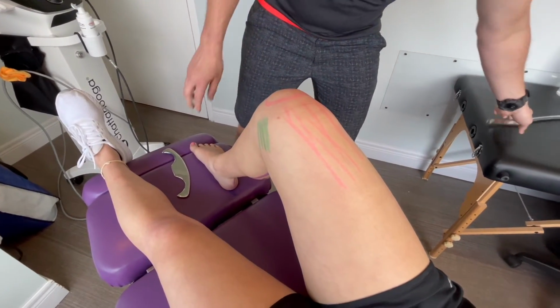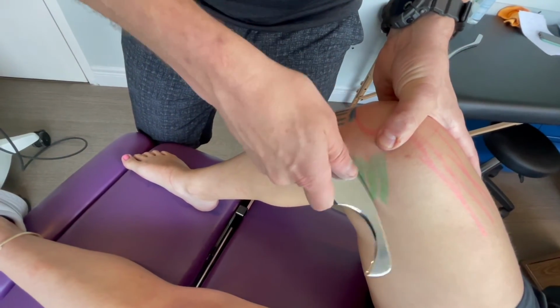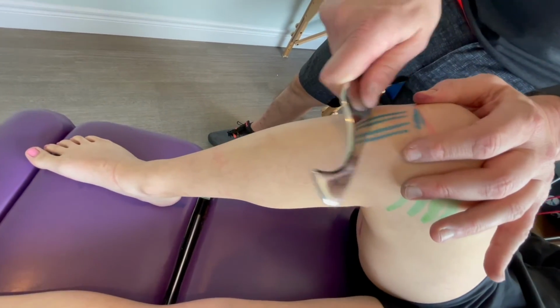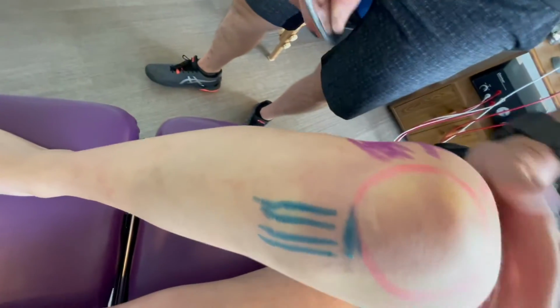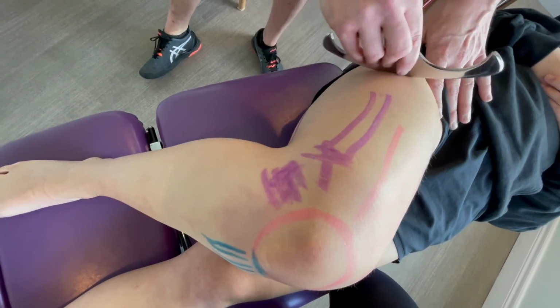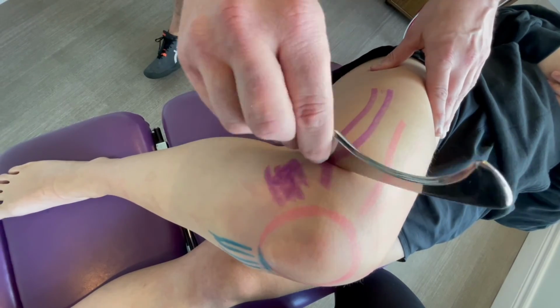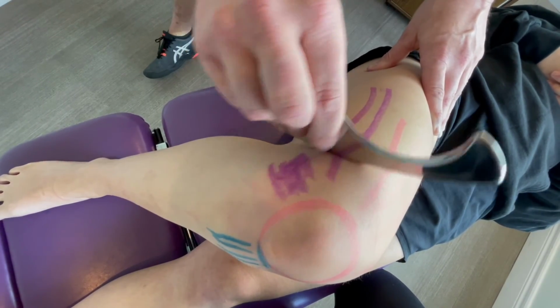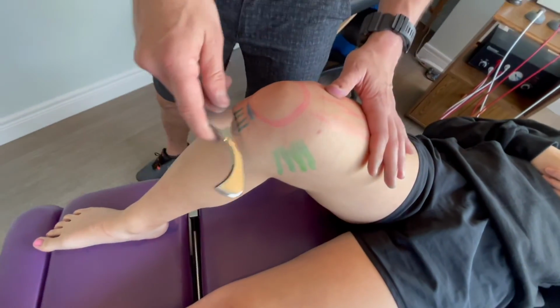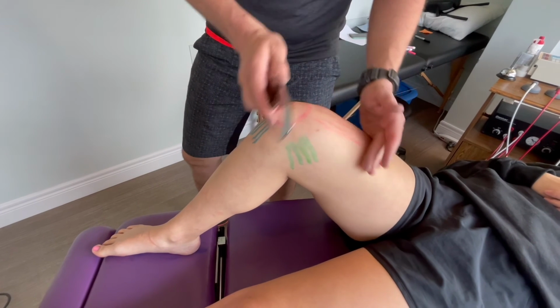If it was a meniscus injury, I'd come in with a different unit and scrape in through the side here. Patellar ligament, I'd come in right like this, and then lateral in there. When it is the IT band, I would do the entire thing. I might bring the big handlebars out too and just work this, but for most people the most pain is right in the bottom here, and even on our model today, I can feel that's pretty bad on her. So for the IT band, scrape through here with the Graston, down to the lower knee. People with Osgood-Schlatter's, same thing. Medial in here, and the big handlebars to the quad area in there.